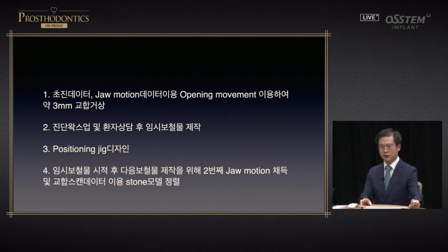Diagnosis was done, a provisional was made, and a bridge was cut and prepped. The prepped form is unanticipated at the time of diagnostic wax-up. I use an eggshell provisional. You need to get the right position when this is placed in the oral cavity to be able to transfer the information. I want to talk about how I did it. A positioning jig was used.